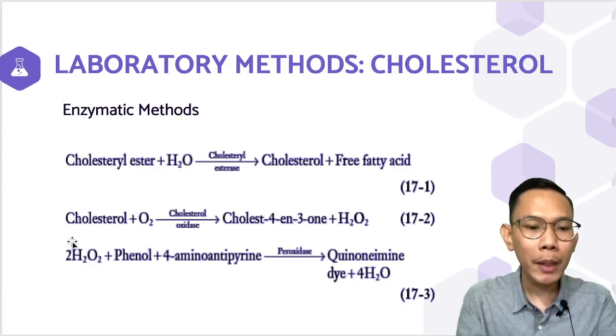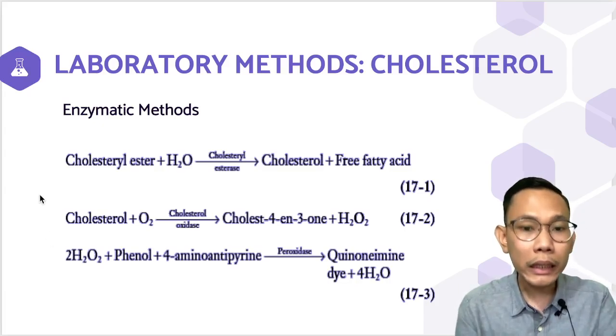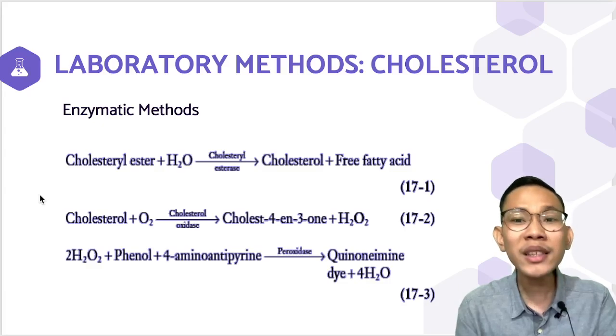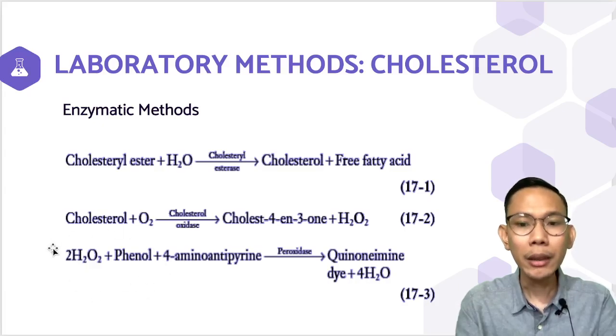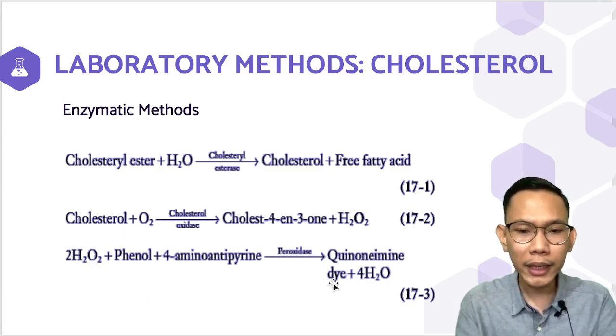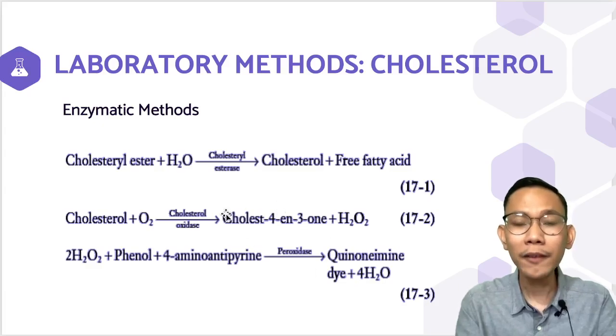So when there is a high level of ascorbic acid or bilirubin, it will consume your hydrogen peroxide, leading to a false decrease of our result, because the hydrogen peroxide is consumed and it is not detected much by our peroxidase. The value will be low.